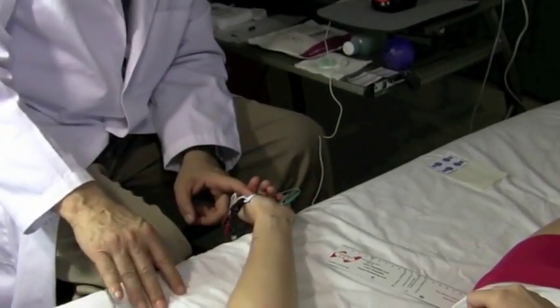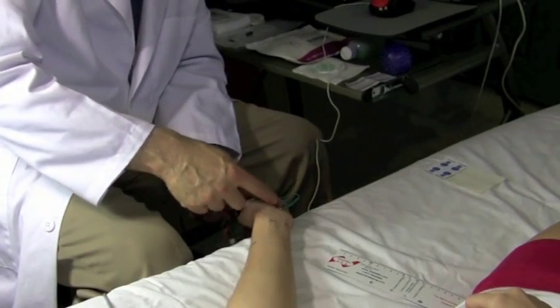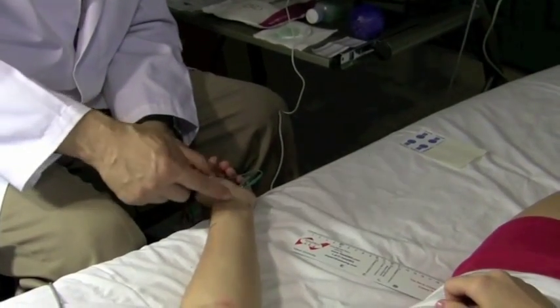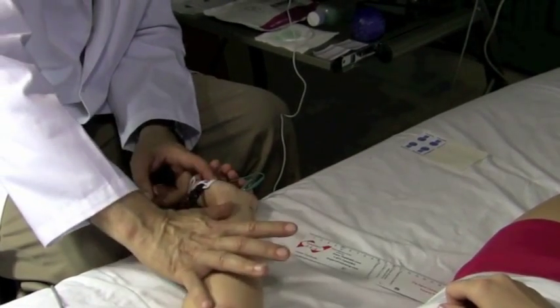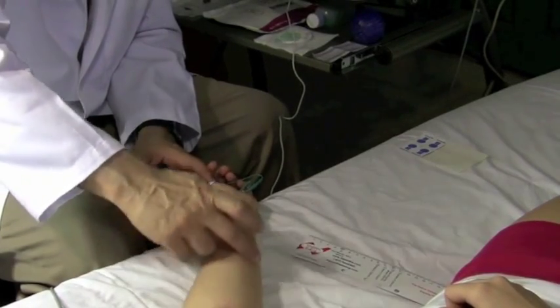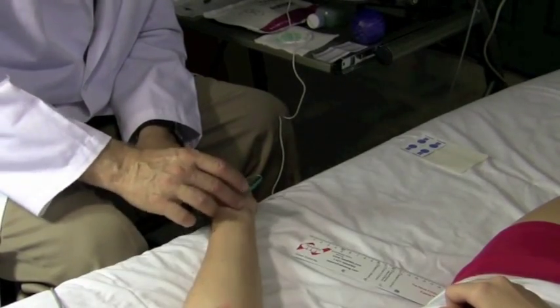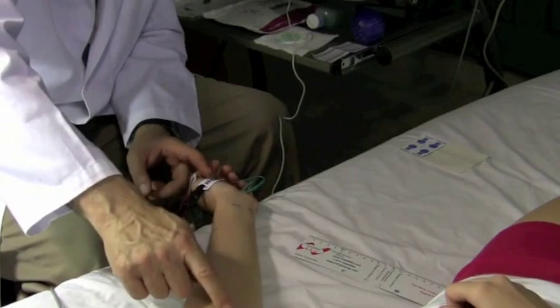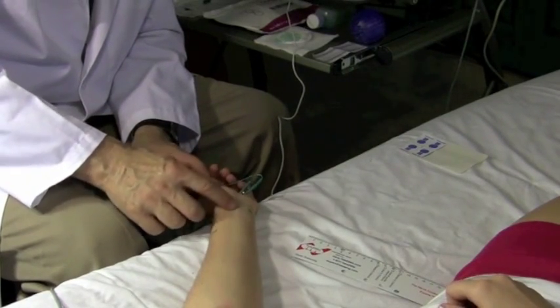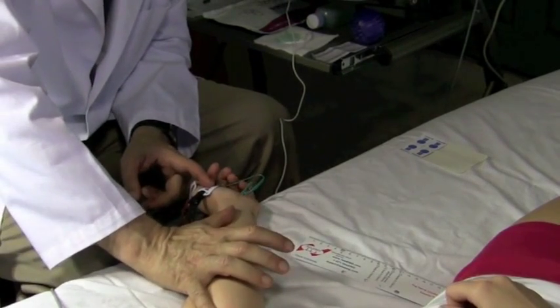So what do I need to do? From here, it's going all the way to the muscle, so that latency is all this. This latency is just that. So if I just want this, I need to take this portion of the latency from this portion of the latency, and so I subtract the distal latency from the proximal latency. Again, this is the whole thing. This is part of it. So if I take this portion out, now I have the latency between elbow and wrist.